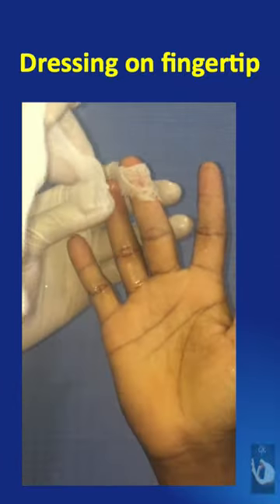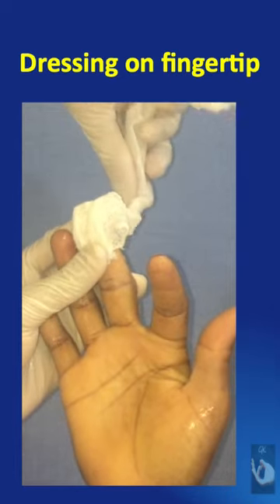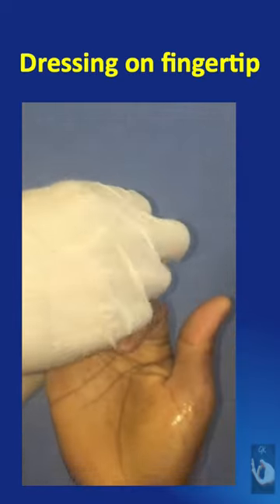Over this, a gauze piece is applied first on the volar aspect, then wound over the tip of the finger to the dorsal aspect, then wound back to the volar aspect, and then taken circumferentially around the finger.